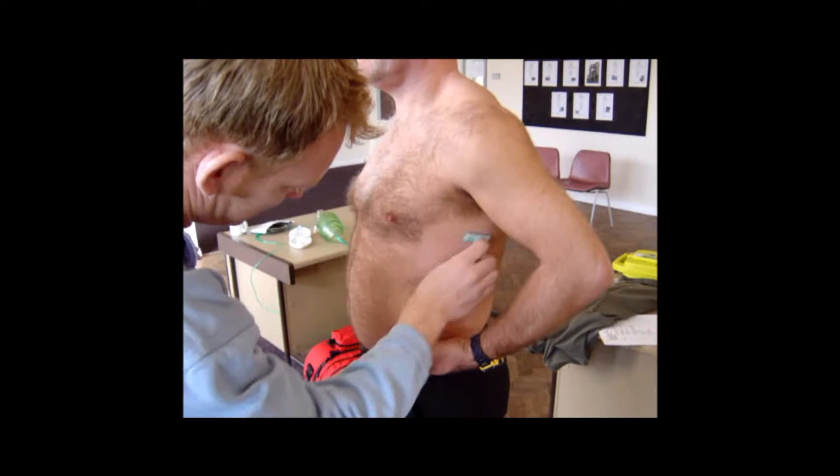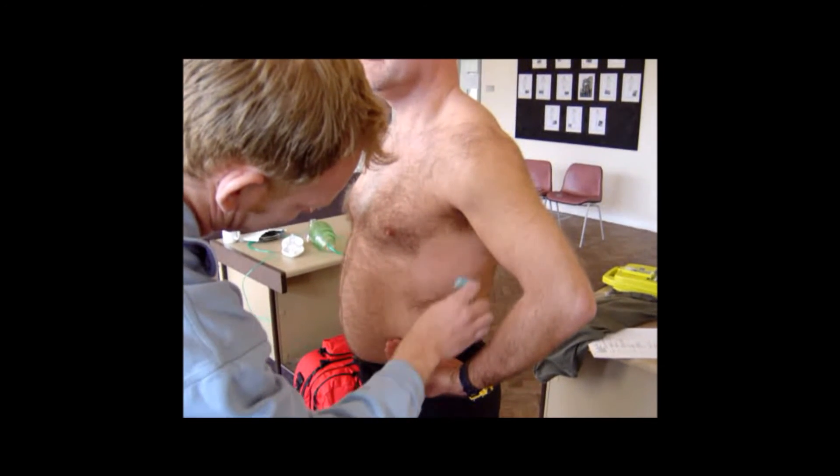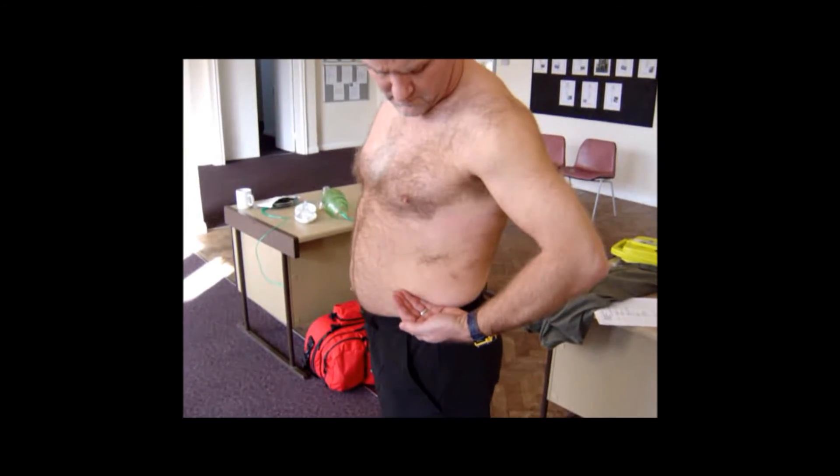It looks like adequate, do you think? Yeah. Just start in the way, do you have to start? 40 seconds. That's not bad, is it?